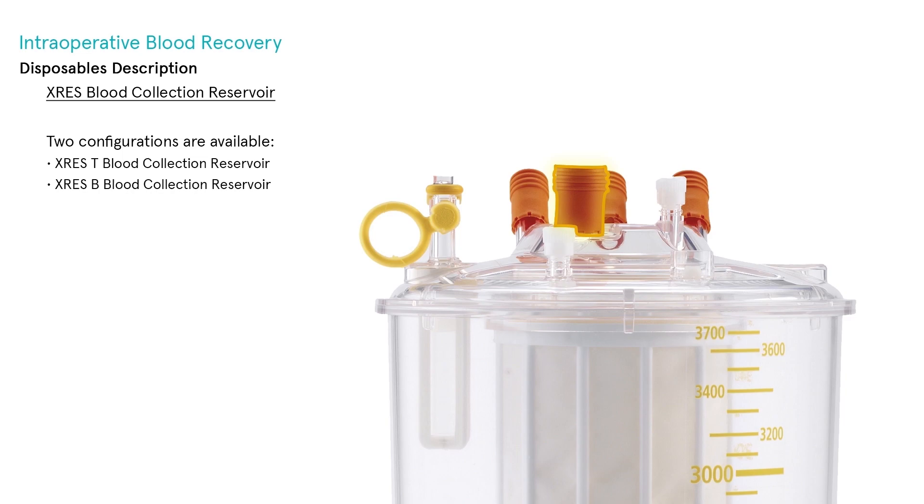The XRES Blood Collection Reservoir features three ¼-inch suction ports for the collection of blood both intraoperatively and postoperatively, angled at 45 degrees to prevent occlusion from debris. One ⅜-inch suction port is used for intraoperative procedures and chest tube drainage in postoperative cardiac surgery. One filtered and one non-filtered luer lock port are provided for blood transfer or drug administration. A pressure self-relief valve opens at negative 255 mmHg to avoid implosion, and a float valve avoids overfilling.